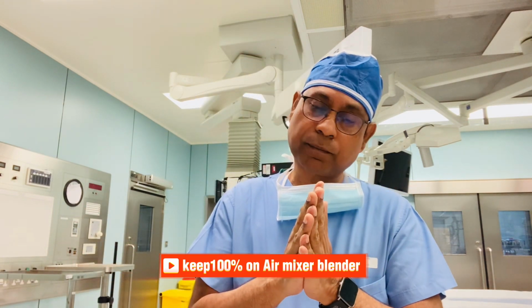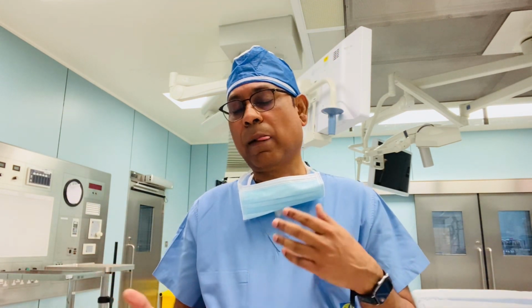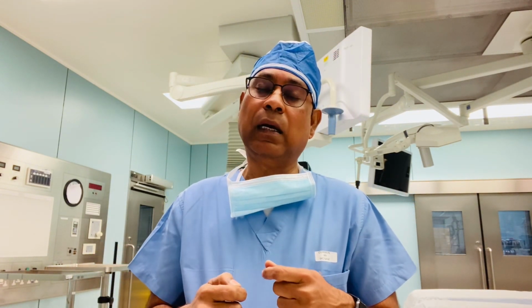This formula will help you understand the transfer of gas through the membrane, and it will help you change your membrane in an elective manner, rather than in the middle of the night when your circuit fails. These types of equations help you a lot to make a pre-plan to change the circuit or the membranes. Hope it is going to help you in your field of perfusion.